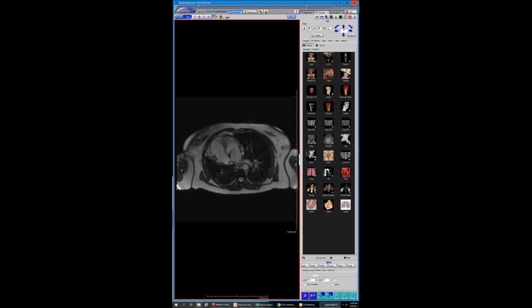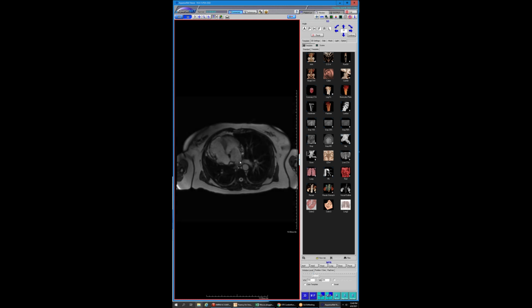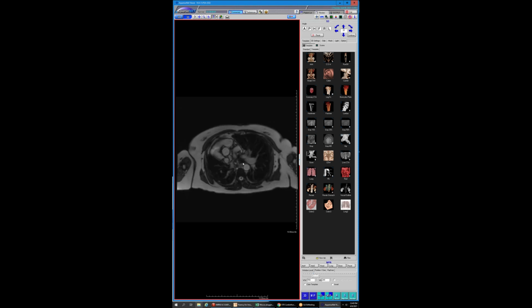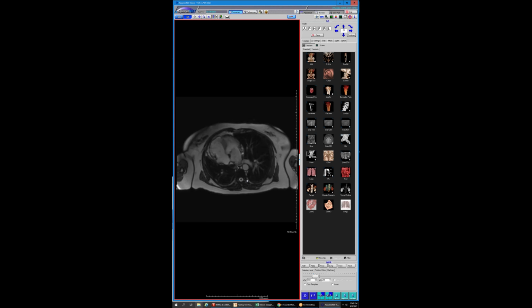like you say, when you're busy and you're not really checking stuff before patients get off the table, you feel stupid. But the tech called me and said, oh, we had a case of an old woman that was here for viability study. And I was like, okay. And I wasn't thinking that much of it. And just the fact that there's dextroposition, I figured she had a lobectomy or something. Anyways, that's not the case.